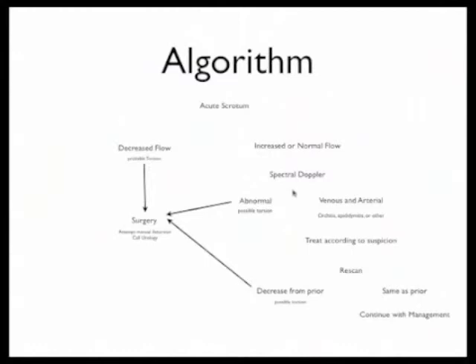Actually, that's not true. I shouldn't say that. Almost half of the patients in that study, 15 out of the 36, had normal ultrasounds of the testicle. So it is going to be a fair percentage, but you're still going to be affecting care in over half of your patients. Yeah. And who knows, as we get better at this, as we do it more, we're going to get better at it.